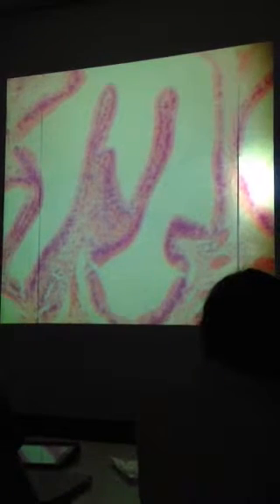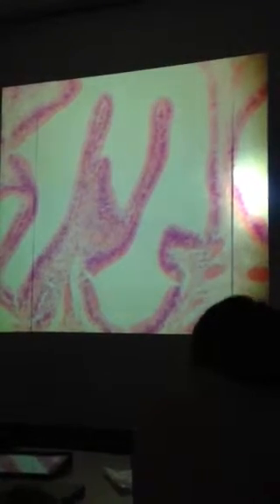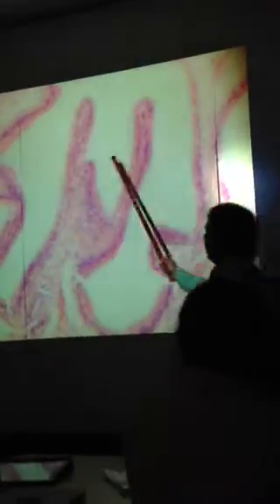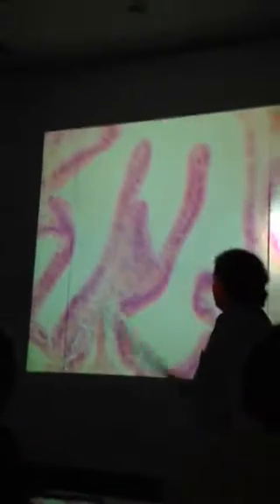What organ? Who drew this one in the gallbladder? I always call this the sloth or monkey reaching for the sky. See how he's got his arms up going, come back and get me. Oh, the little alien guy. There's his head, there's his two arms. But this is the gallbladder, which has these bizarre little extensions that come off.